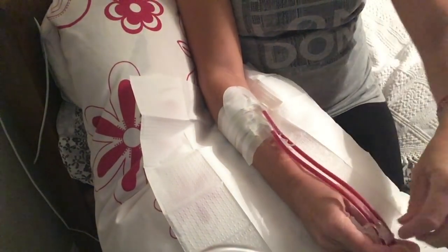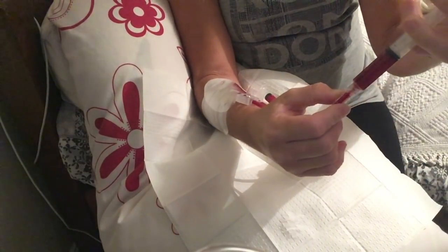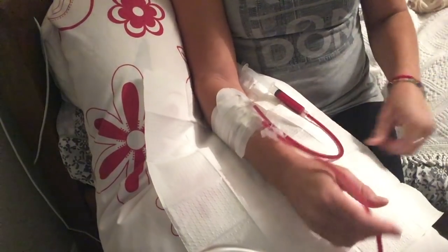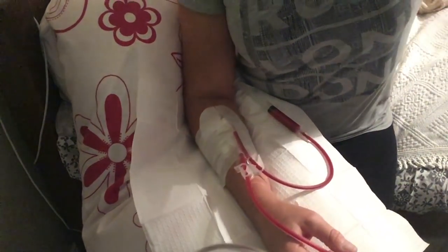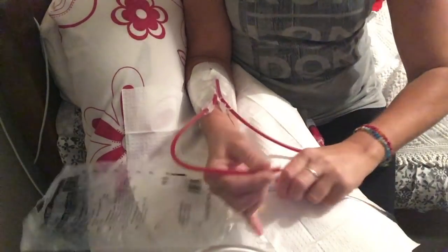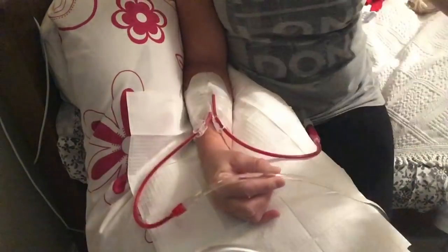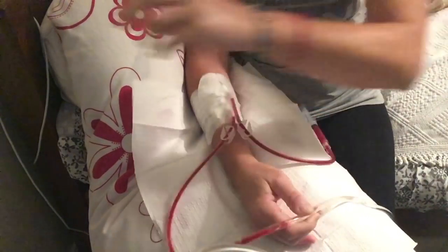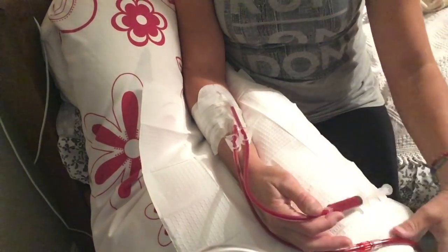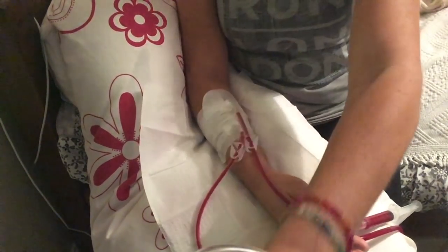I use the bleed-out connection method, so I connect my arterial needle to the circuit first and bleed blood right through the blood lines until it reaches the other end of the circuit, then connect my venous. I disconnect the arterial line from the saline bag and connect straight up to me. Then I open both clamps — one on the blood line and one on the needle. I start the blood pump slowly, around 50, to make sure it feels okay, then turn up to about 110 mils for bleed-out.